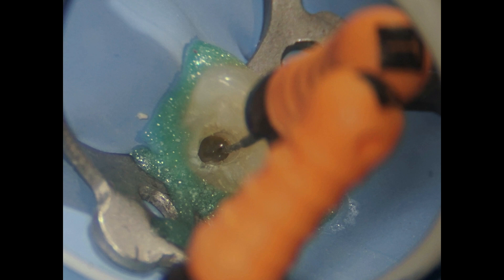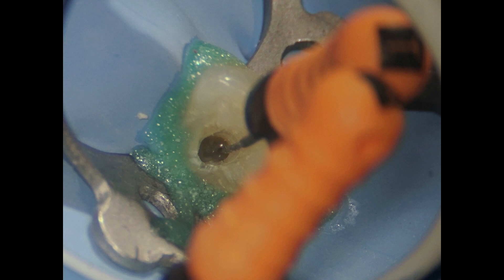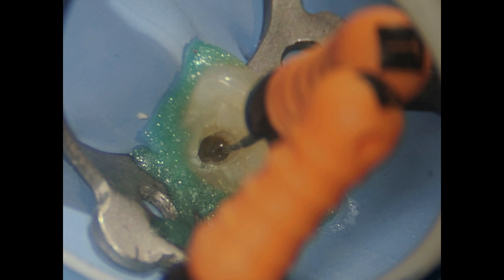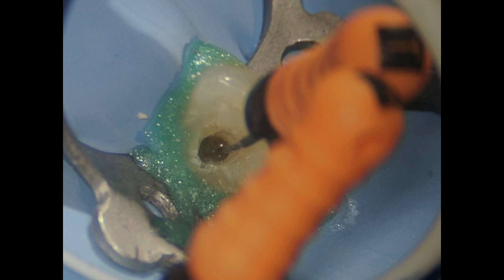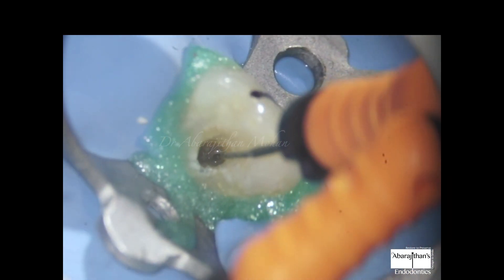This particular orange file is from NeoEndo, called the Neo Pro. I prefer it because it's a size 12.5 tip — between size 10 and 15 — so it has the right balance between flexibility and stiffness to negotiate these canals. I use a gentle watch-winding motion patiently until I reach the apex. Once you locate the patent canal, negotiating these canals is not too difficult, because calcified canals are more calcified in the pulp chamber and coronal third, whereas the middle and apical third is generally patent — especially in necrotic cases.